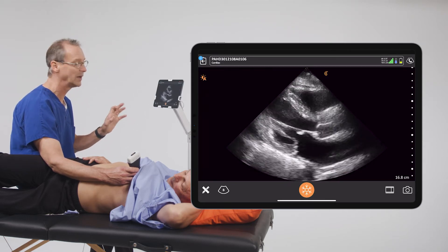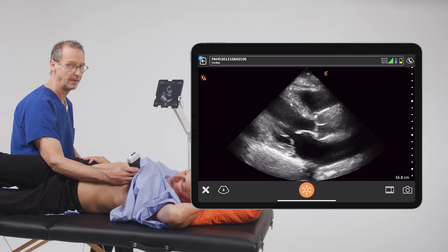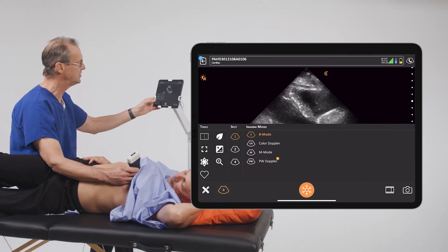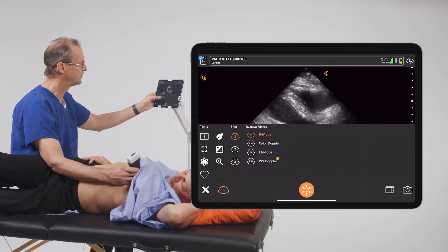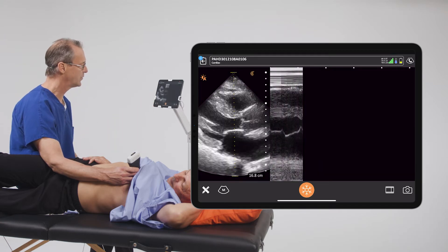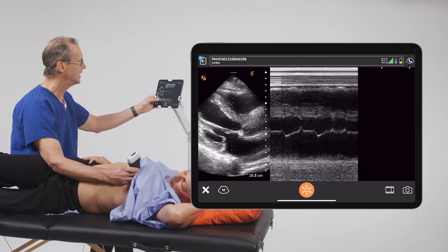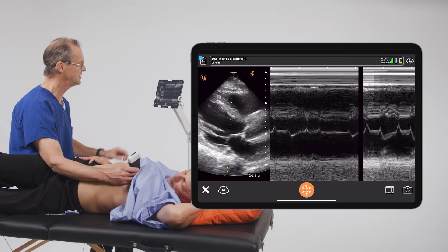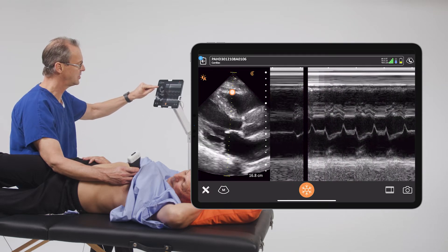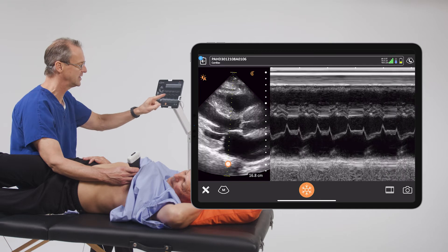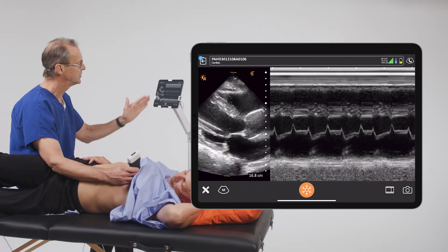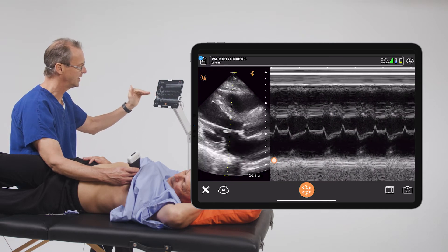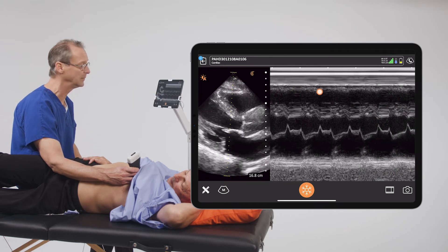EPSS allows us to quantify that movement of the anterior leaflet. To do that, we'll go into M mode. M mode stands for motion mode, and what it does is it takes all the changes in echogenicity along this line and maps it out over time. The y-axis is depth and the x-axis is time.